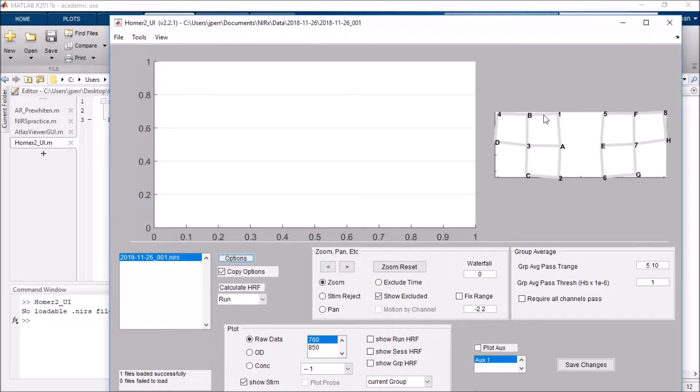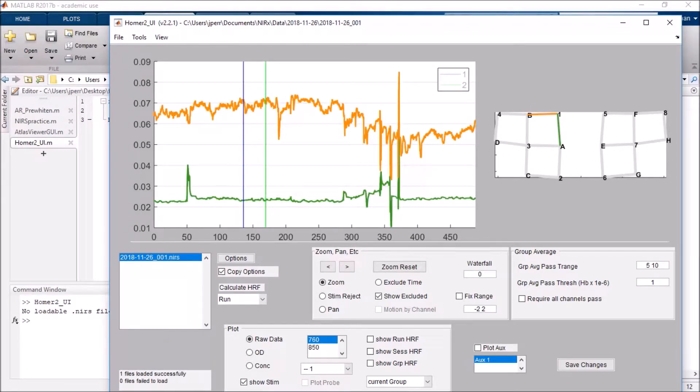I'll go ahead and just view two channels here. There you go. You can also see my two triggers. And I'll go ahead and run it.